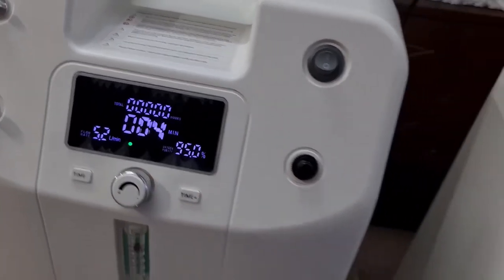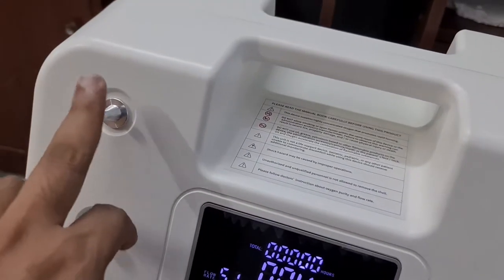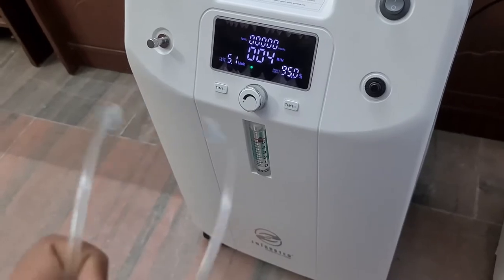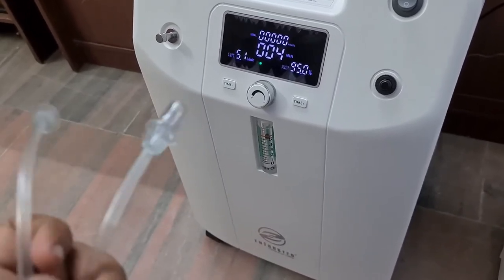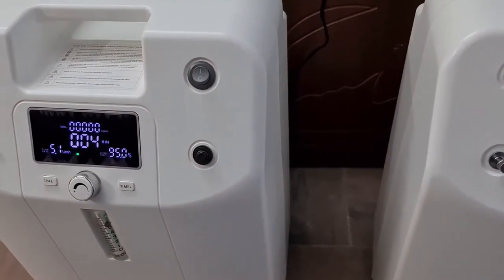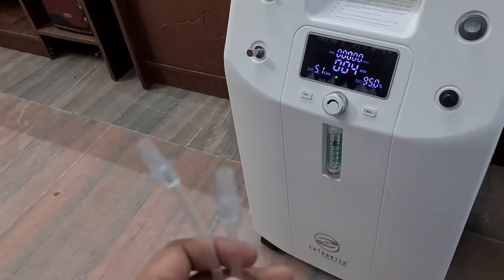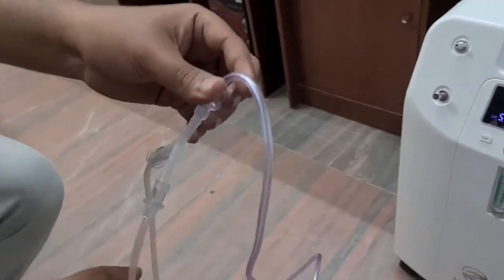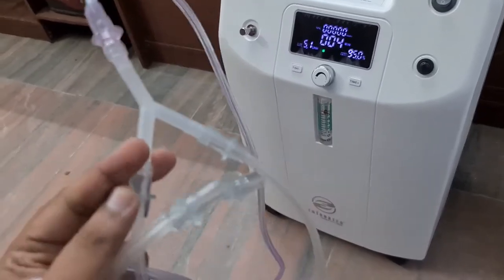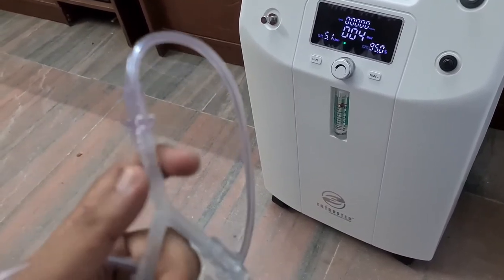As shown in previous videos, this is where the oxygen output comes from. This setup is called the Y-connector setup. These connectors are available at all Entrusted stores. If you have already purchased a 5-liter machine and are purchasing another because the flow rate has been increased for the patient, you can request this from our technicians and biomedical engineers. This is how the Y-connector looks.